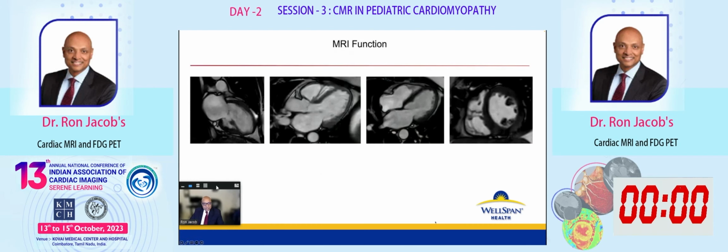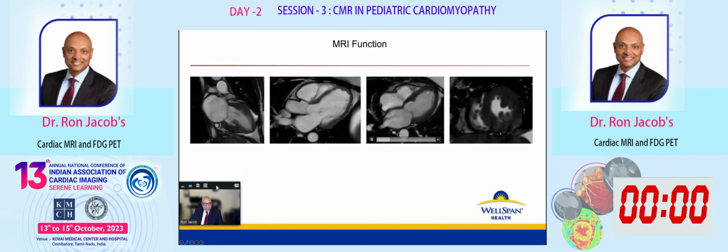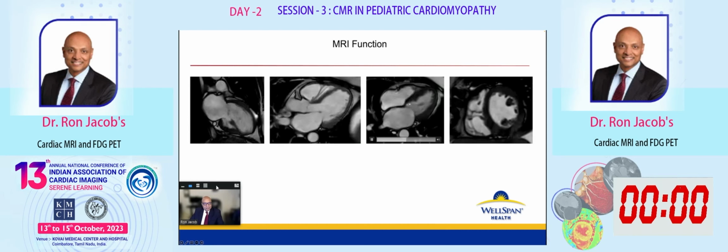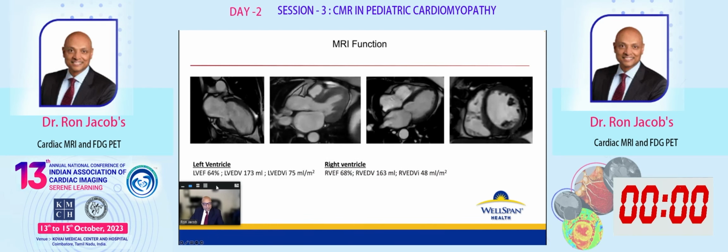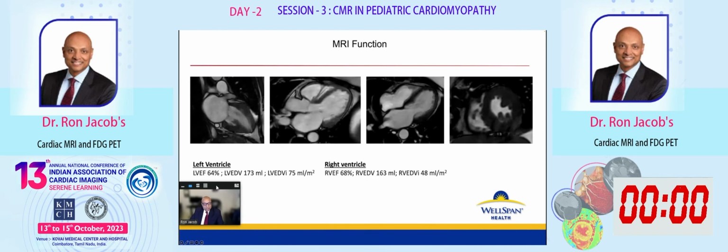So this is our patient's CMR, and you can see the right ventricle quite well, normal LV function, no regional wall motion abnormalities. Things to look for are septal thinning and any focal wall motion abnormalities, including of the right ventricle. But this looks, in my estimation, quite normal. So the right and left ventricular ejection fractions are normal. The end-diastolic volumes are normal.